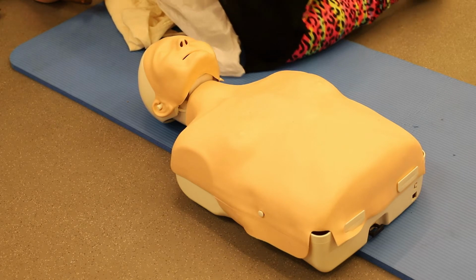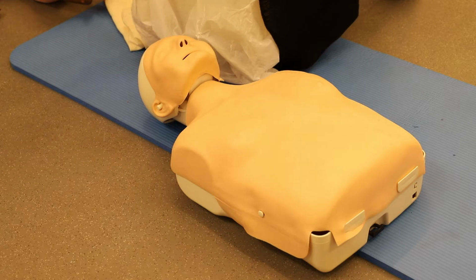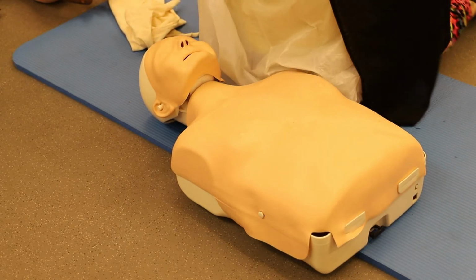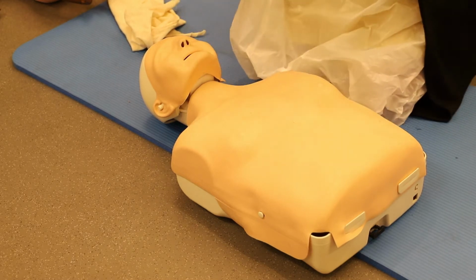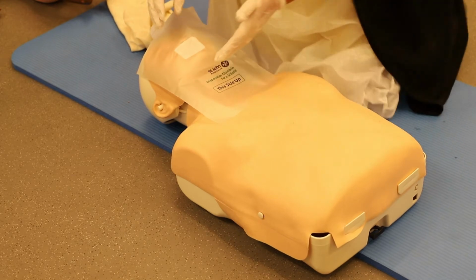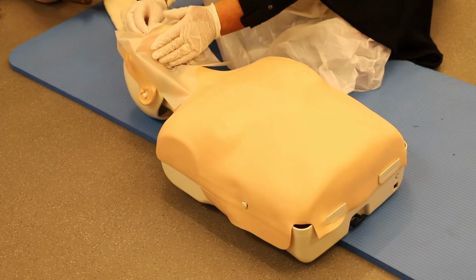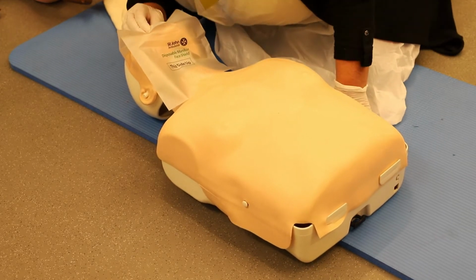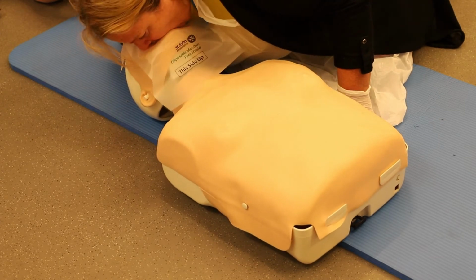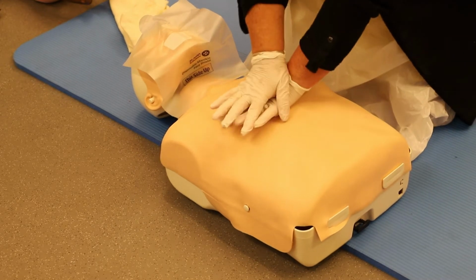When we're giving our casualty 2 breaths, we will need to use a face shield to help protect our casualty from us and us from them. Place the face shield over their mouth. Tilt their head back again and pinch their nose. Put your mouth over the mouth shield and blow twice. 1, 2, and then commence your 30 compressions again.